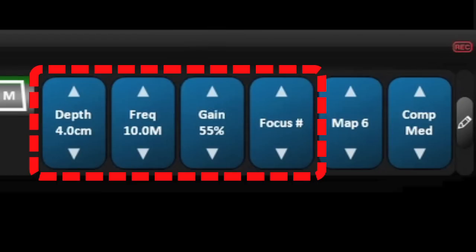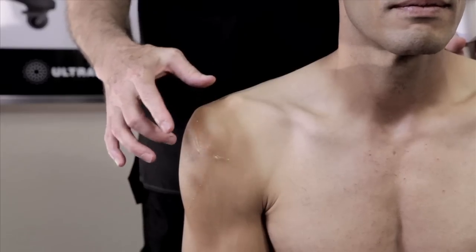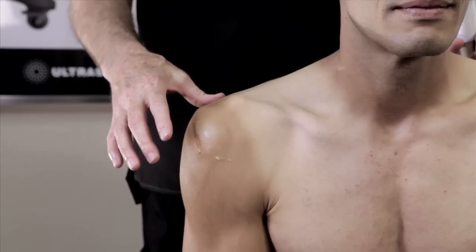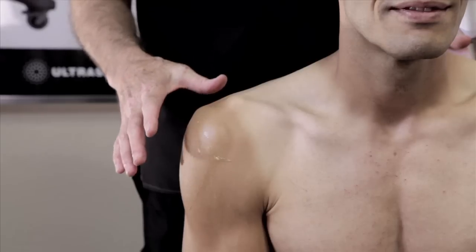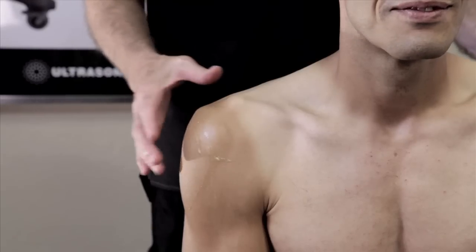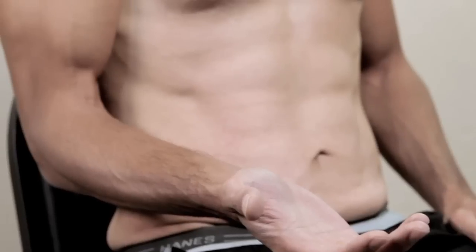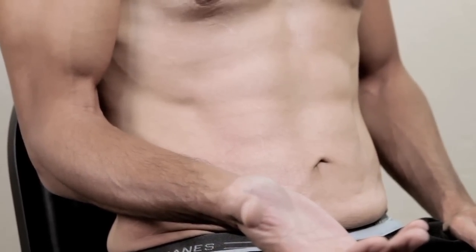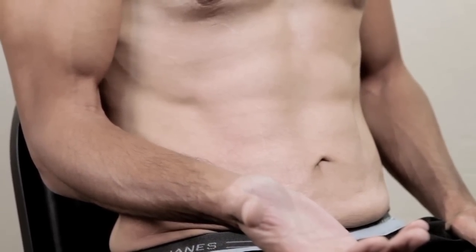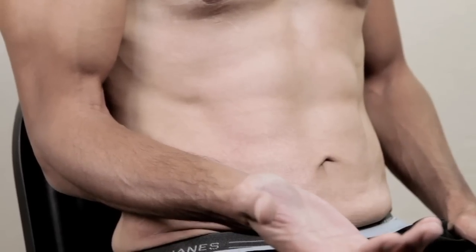We're going to start with the short axis probe placement to visualize the biceps tendon and the bicipital groove. Patient position is as you see here with the patient seated upright, the elbow flexed at 90 degrees, the palm turned up in a relaxed supination.